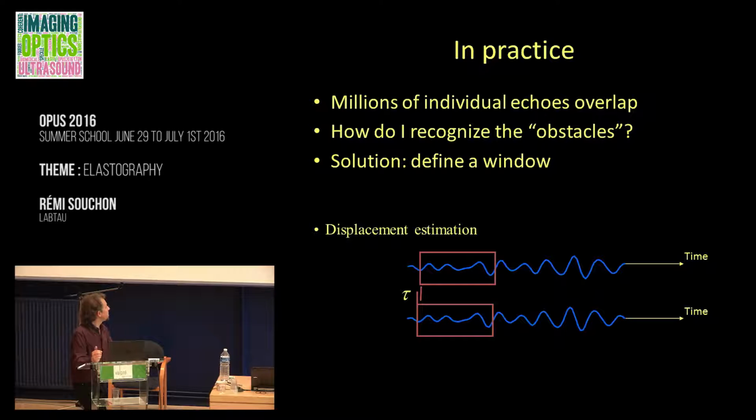So that's how we recognize the signal, by picking a window that is long enough, and that is a trade-off here. By taking a window that's long enough, you can recognize some signature, and you search for this same window on the next signal, and actually measure a new time delay here, but it's not exactly between individual obstacles, but between a group of obstacles.